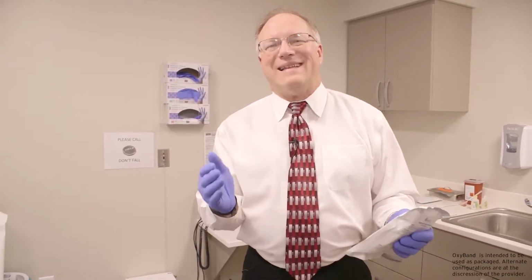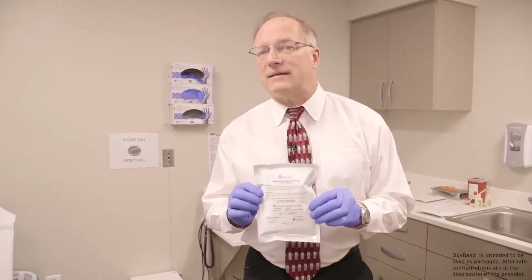If we could have a dressing that would accomplish that, we could elevate tissue oxygen tensions above the threshold required for wound healing. We know that below 30 millimeters of mercury, fibroblasts don't do their job. Other cells important in the healing process, such as epithelial cells, again, stagnate or are operating at a suboptimal level, delaying wound healing.